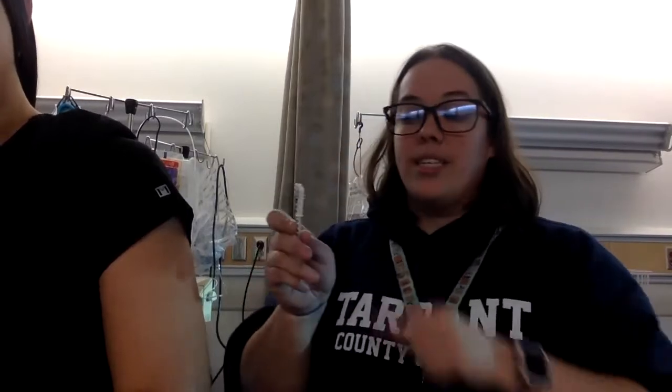I'm not going to do it with this one because I don't want to waste it, but as soon as you're done injecting, with this insulin syringe, you take your thumb and push this white thing up, and it's a safety for it. For the Lovenox, there's a spot on the bottom of the syringe, because those are already pre-filled. You push up really hard on the bottom and a safety comes out. Anytime with the needle, you want to make sure that you are not just leaving it out or walking around with it, because that's easily asking for a problem. So I'm going to get this to my sharps container as soon as possible.